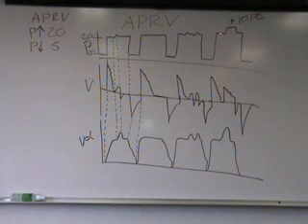So here on P high, the patient starts to inhale a spontaneous breath, triggers that pressure-supported breath. The pressure-supported breath goes up to the pressure level, stays at that pressure level until the flow rate decelerates to the terminal flow sensitivity, and then that pressure-supported breath shuts off, which gives me expiratory flow here, which shows me the volume coming back from that pressure-supported breath, until the end of my P high time, in which the volume that was delivered here now is exhaled here, and it comes back out here.